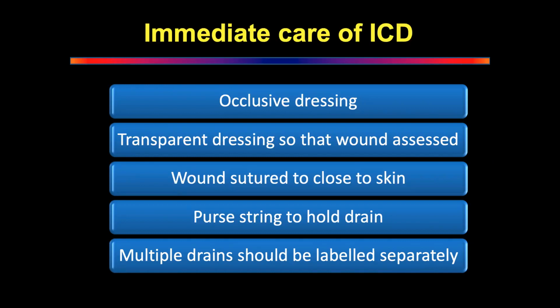Okay. Now somebody can tell me how to connect a suction. Should you connect multiple bottles or should you connect one bottle? First question. Ideally, separate bottles. Not suction, I'm talking about bottles. Forget the suction first. Separate bottles. So in an exam, if somebody tells you, I would like to connect separate bottles for separate drains, that's the answer. Because then you don't get mixed up and you don't know which is bubbling, which is not bubbling. So it's a good idea in thoracic surgery to connect separate bottles.